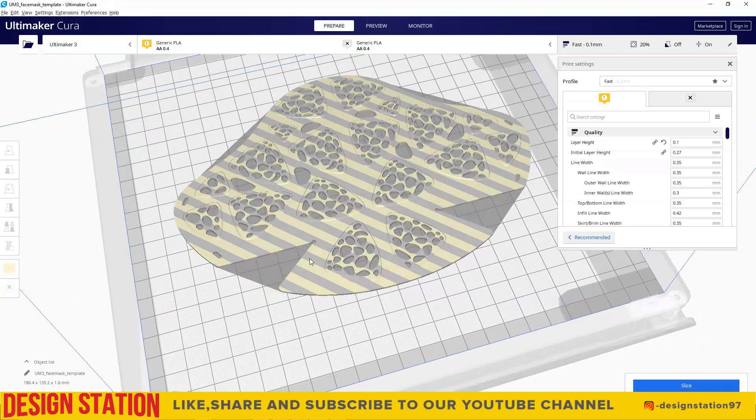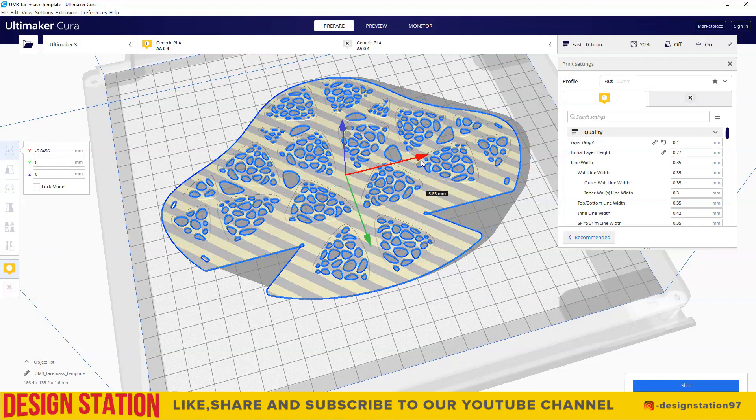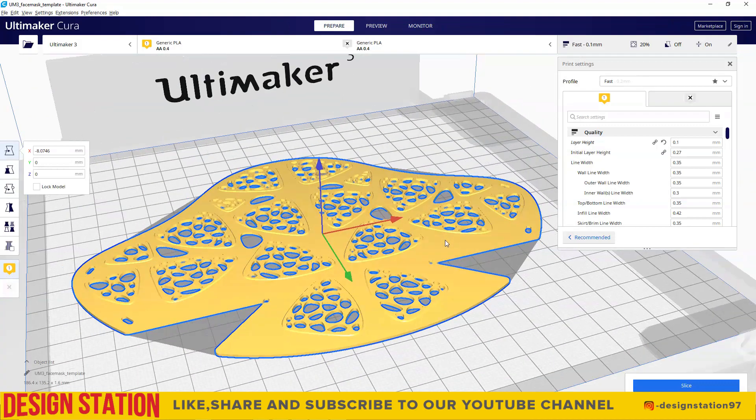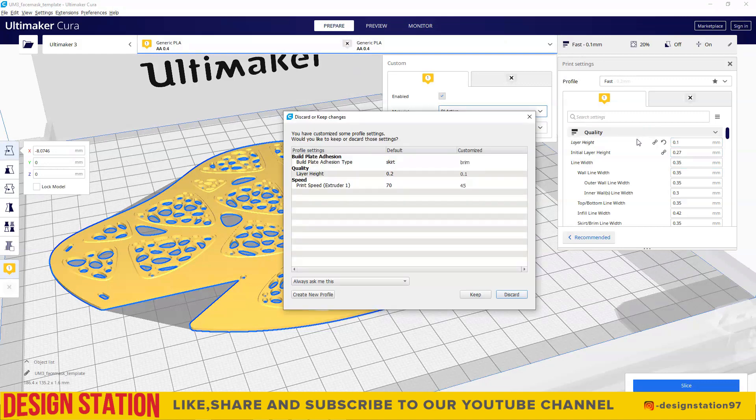If the model is textured in the following manner, it means it has to be arranged properly in the build plate. Use T to position the model in the build plate. For the medical purpose we prefer the copper 3D PLA filament.